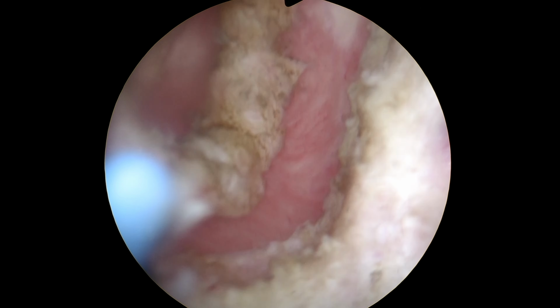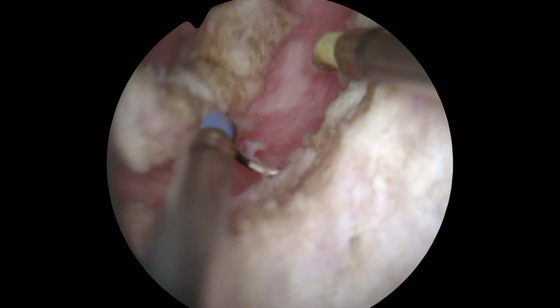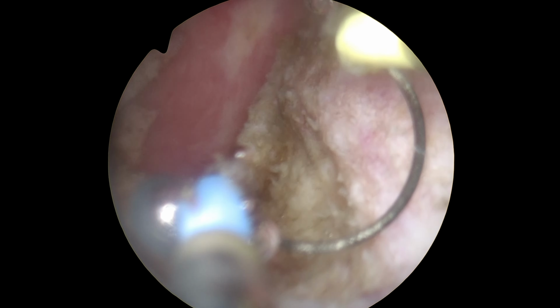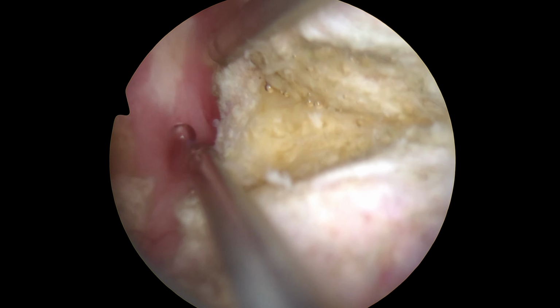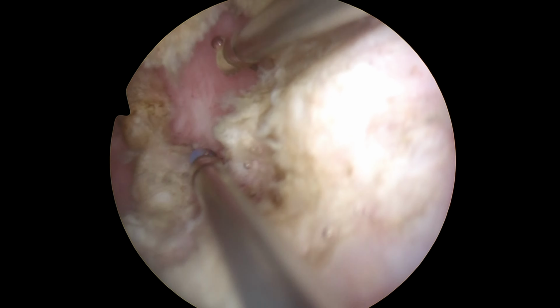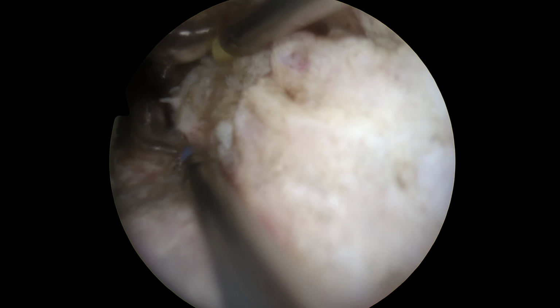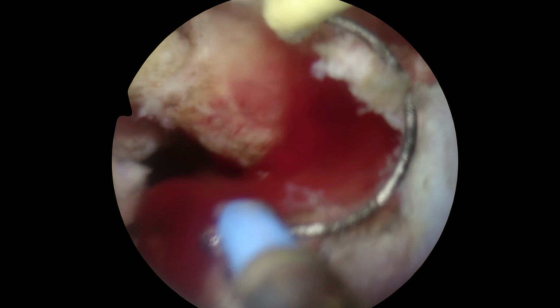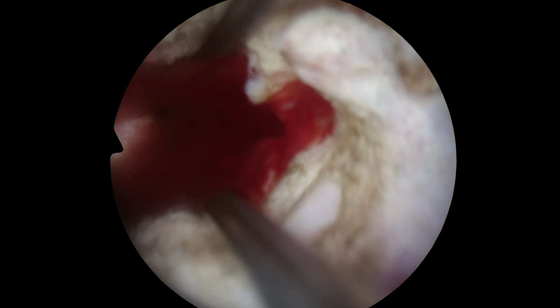So I slightly expand the tunnel towards the left wall of the uterus, and as I already said, abundant blood supply indicates that we are close to the pedicle. So the normal intrauterine anatomy is almost visible. And again, I continue the lateral resection and open up space for myself.